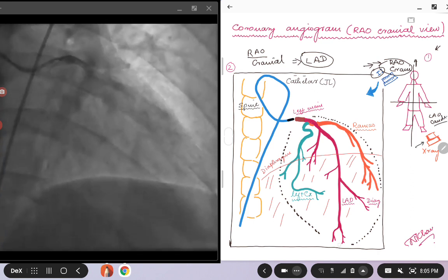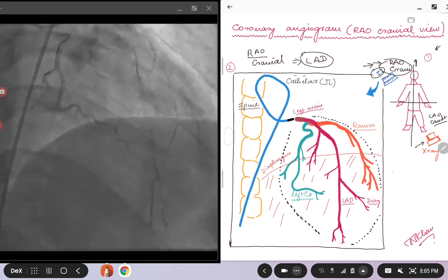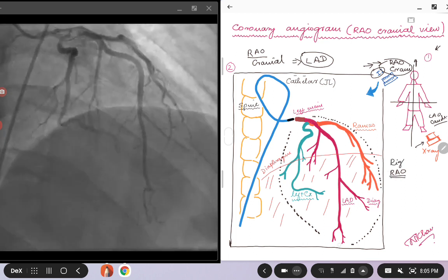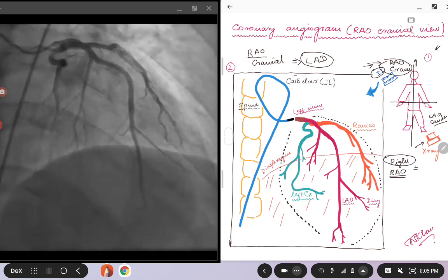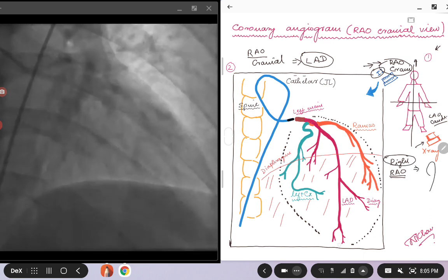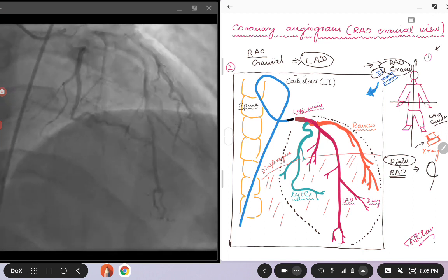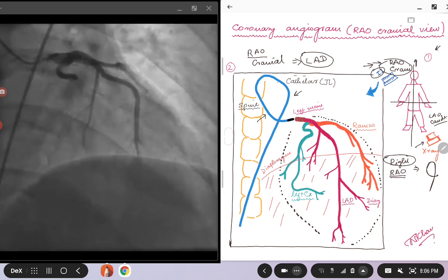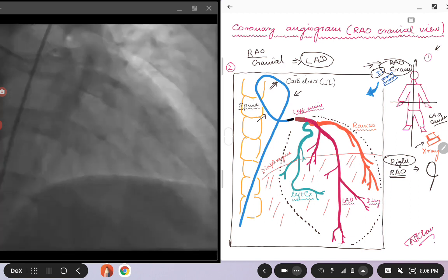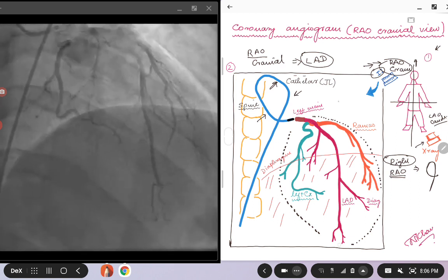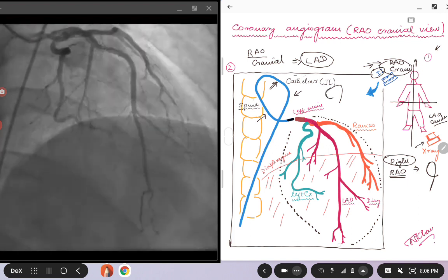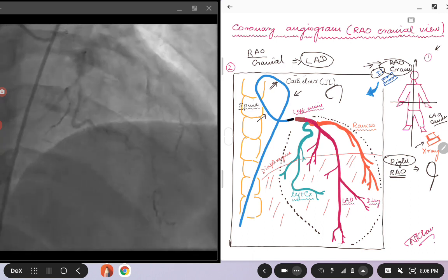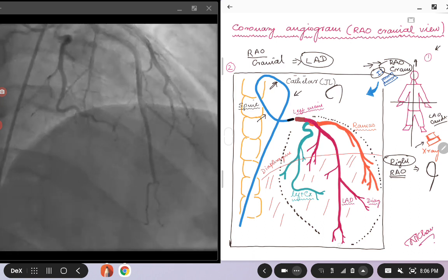We come to the first thing, looking at the catheter. As we talked in the beginning, in the RAO views or basically in the right-sided views, the catheter will be retracted, they will be folded on itself. In this case, if you look at picture two, you see that the catheter is kind of folded on itself, as compared to the LAO views, where most of the time you will see the catheters to be open. This is going to give you a clue that the image you are looking at is mostly the RAO view.